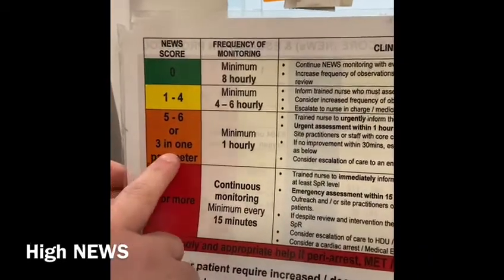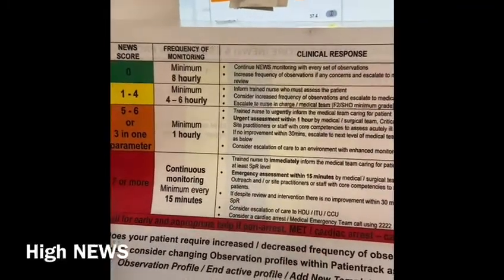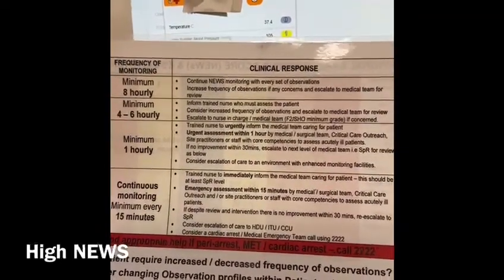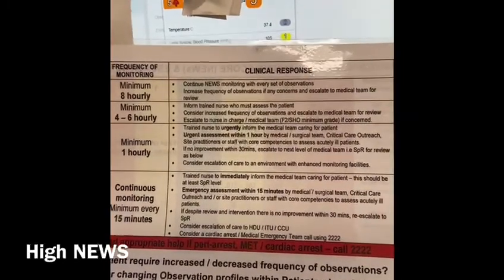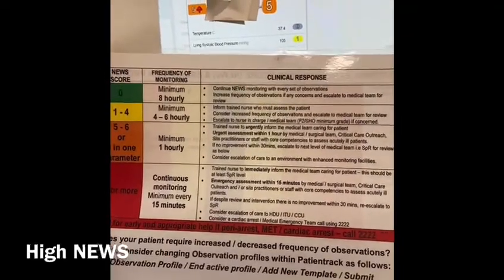She's a 5, or a 3 on one parameter, so she'll be on hourly observations now. I need to inform the trained nurse or the medical team immediately, and she'll be assessed by the team on the ward. If there's no improvement within 30 minutes, then she'll be escalated to more senior doctors or outreach.